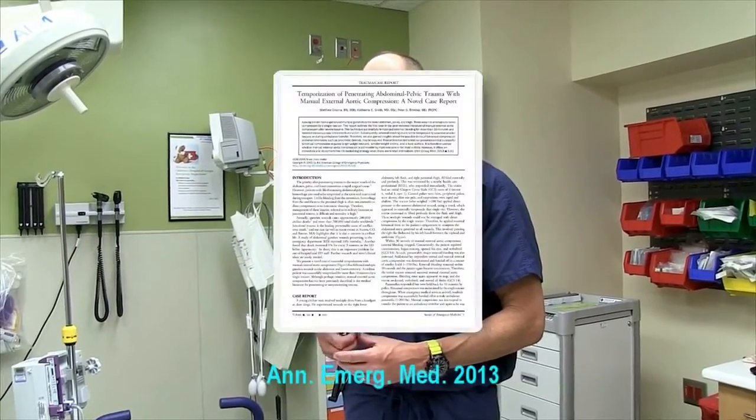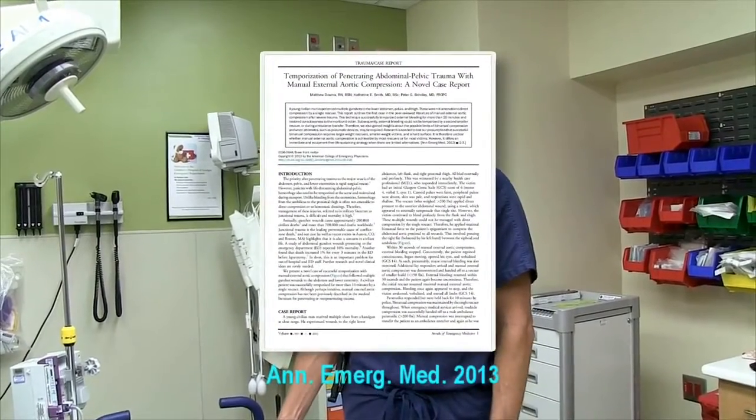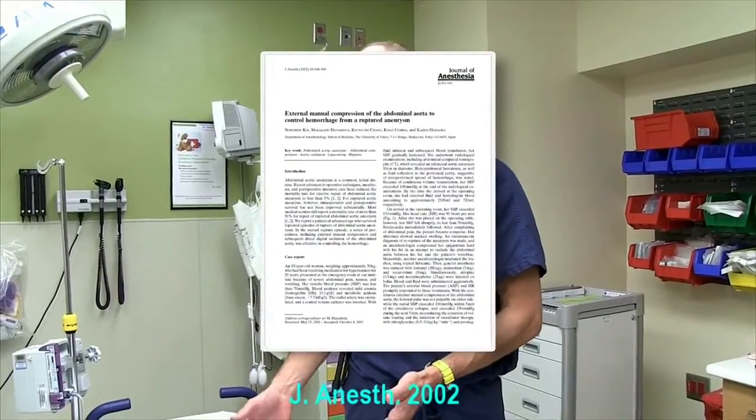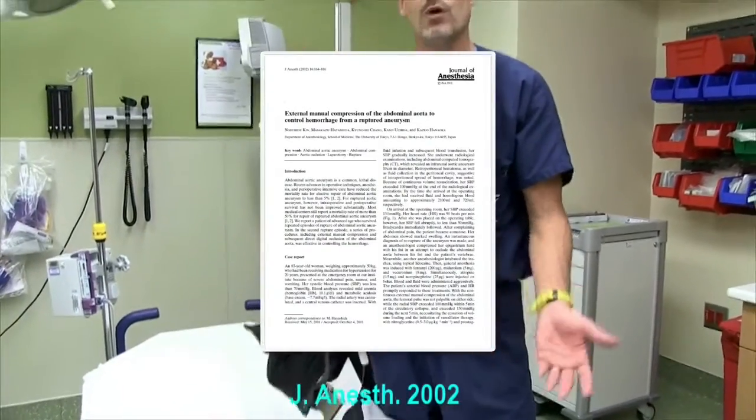There's actually a case report in the Annals of Emergency Medicine of an individual using just manual compression over the aorta to control hemorrhage from a penetrating pelvic injury. This is something that's really been talked about in the Special Forces medic training for years. We're starting to see case reports in the civilian literature using just external compression. The nice thing is with a device like this, once it's placed, it's very stable — you don't come off the aorta when moving the casualty.